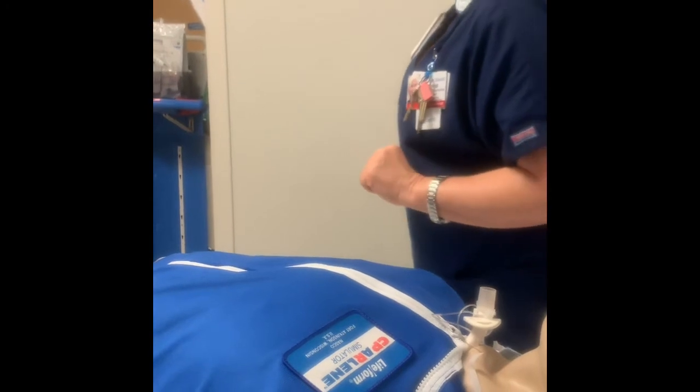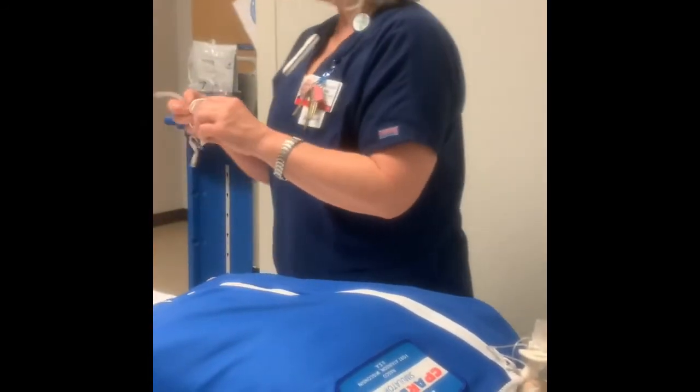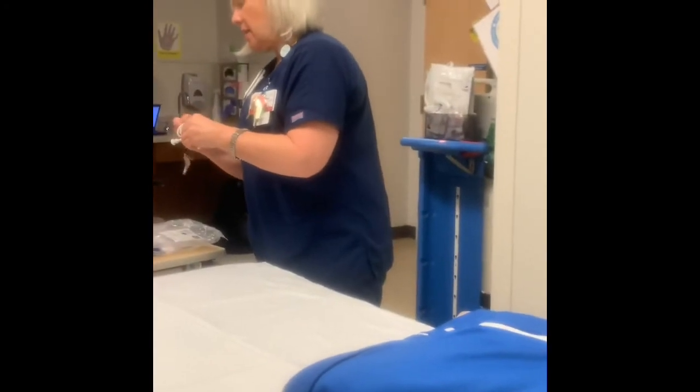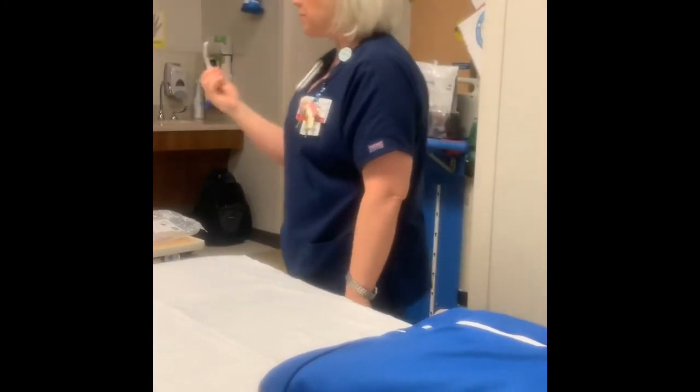Any questions? So what do I need at the bedside at all times with a trach? Obturator. What's the purpose of my obturator? Very good. Okay, so now you know probably a lot more than nurses know, because most nurses you talk to about these things think you put them in a stoma and keep it open. It's not what the purpose of that is.